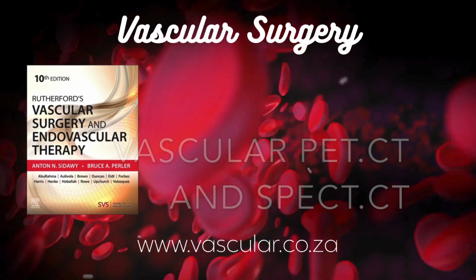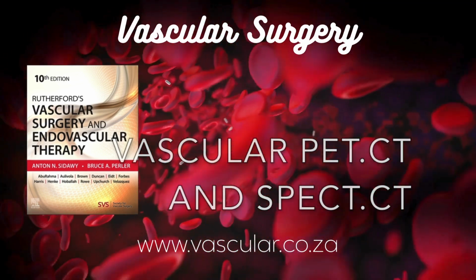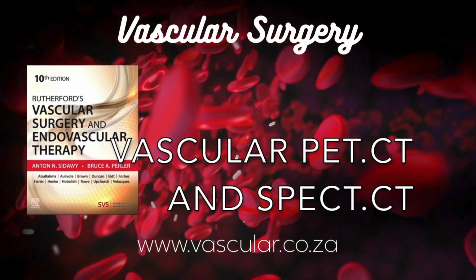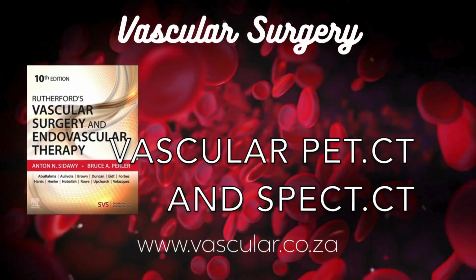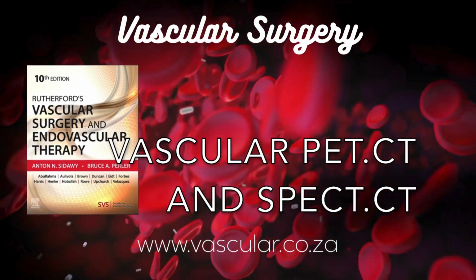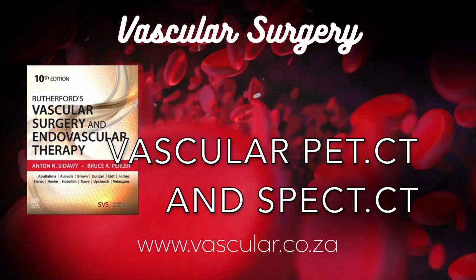And there are official guidelines now. Yes, crucial point. Major nuclear medicine and cardiology societies put out a joint procedural recommendation paper on using FDG-PET/CT in large vessel vasculitis and polymyalgia rheumatica. It standardizes how to do the scans and read them. It's now the internationally accepted standard. Fantastic. So a powerful tool for early diagnosis, assessing activity, and monitoring treatment with standardized approaches emerging. Absolutely. It can visualize the inflammation early, potentially preventing serious complications like vessel blockage.